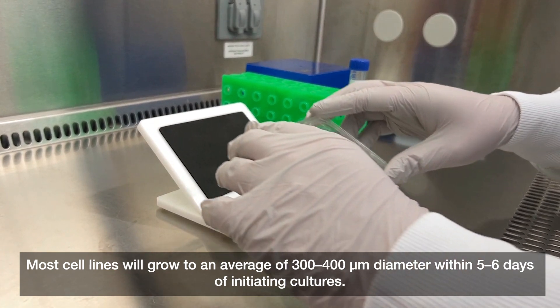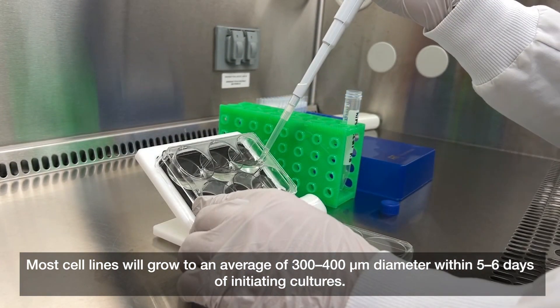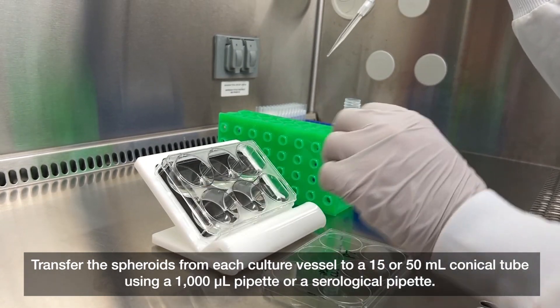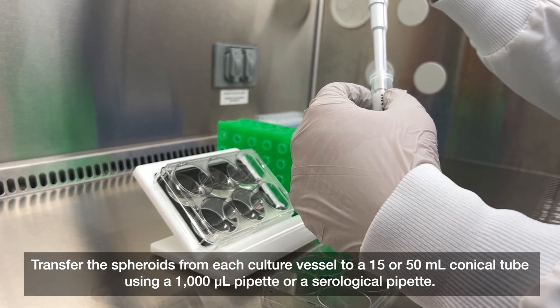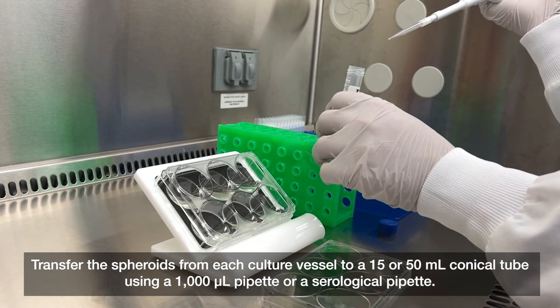Most cell lines will grow to an average of 300 to 400 micrometers in diameter within five to six days of initiating cultures. Transfer the spheroids from each culture vessel to a 15 or 50 milliliter conical tube using a 1000 microliter pipette or a serological pipette.